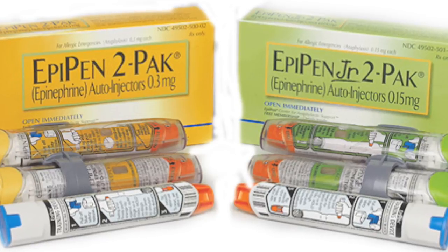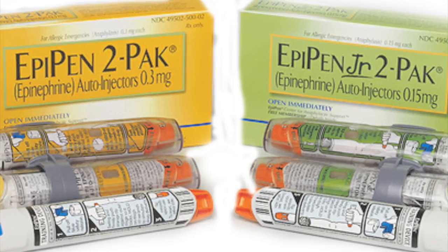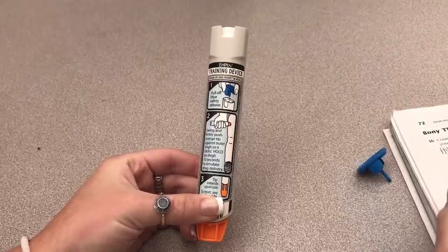Then flip the cap open on the tube and slide out the pen. Make sure to hold the EpiPen with the blue tip up and the orange tip down. After it is out of the tube, remove the blue cap that serves as a safety release by pulling straight up without bending or twisting it.